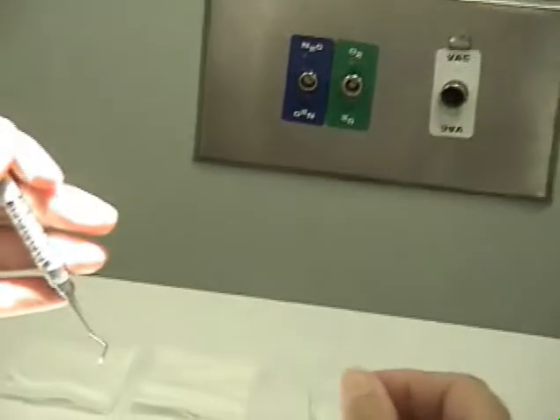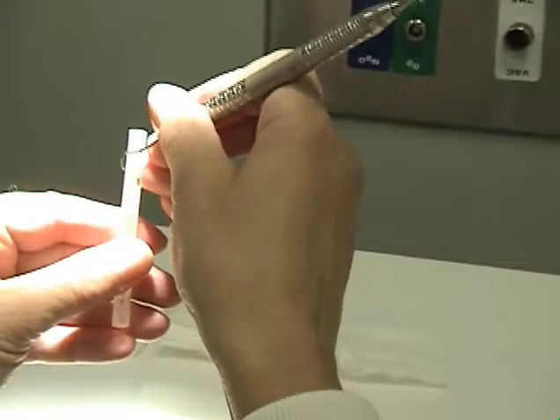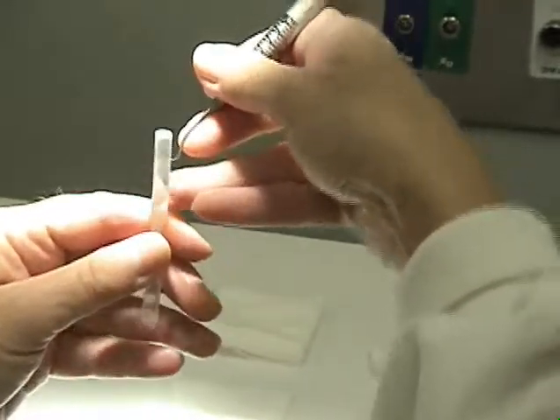Now it's time to check against a test stick, and you'll be checking four blade surfaces.